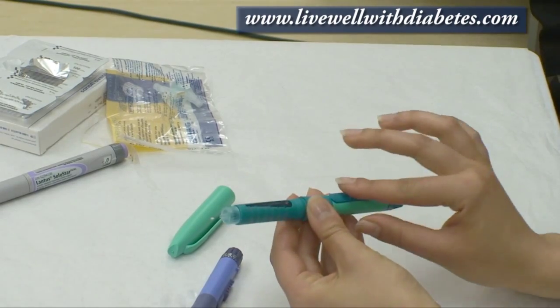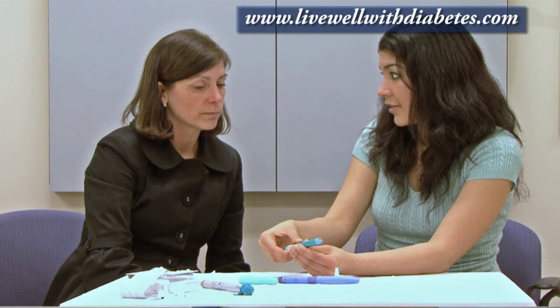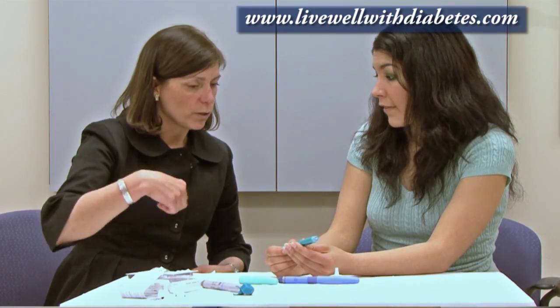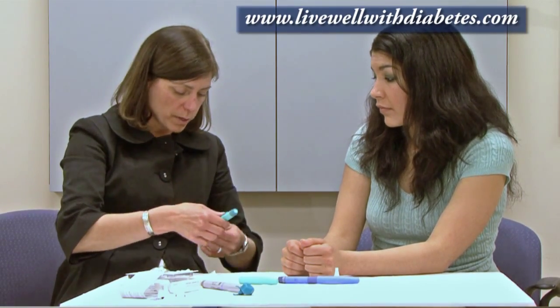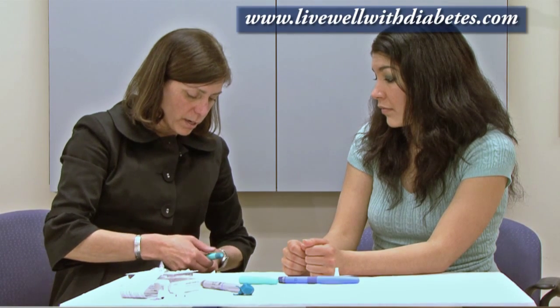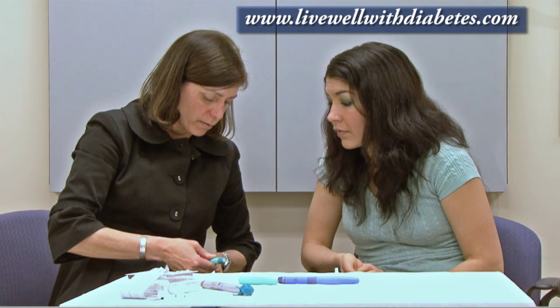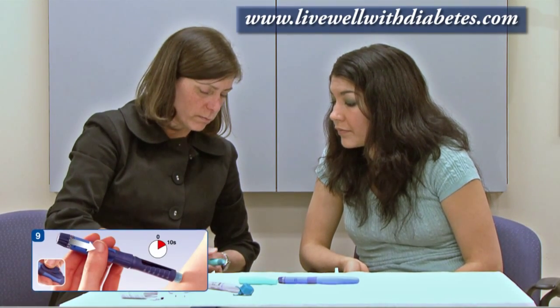Once I push that, do I hold it in there for six seconds? Yes. When you're injecting the insulin you slide it down, and you don't have to hold the button all the way the entire time — you keep it in your tummy and wait to see that this line matches up. You can let go of the button once it's slid down.